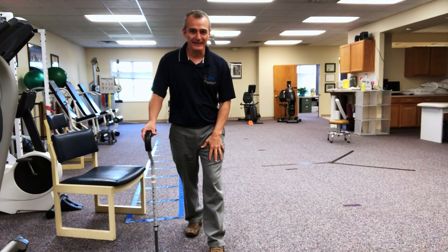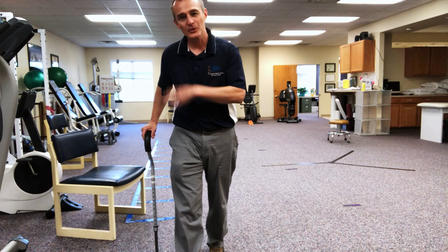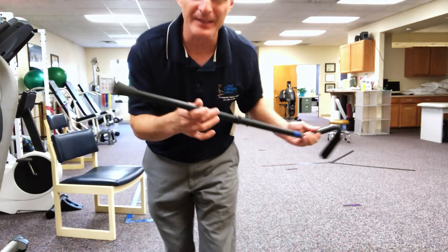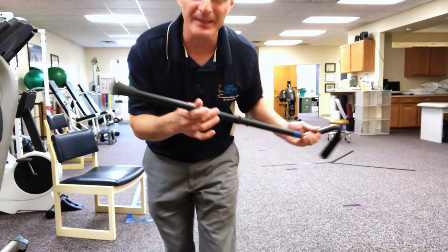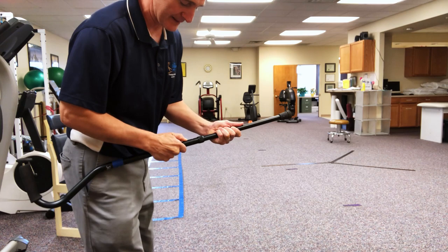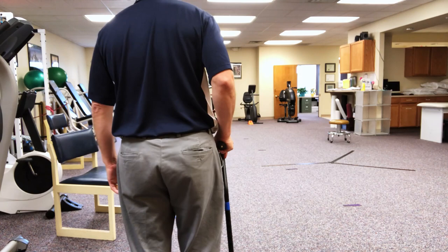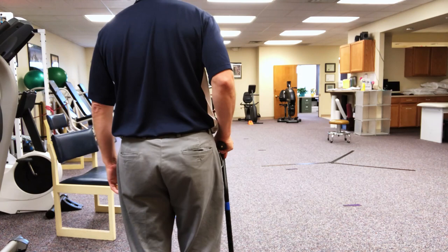The pattern is: cane and surgical leg move forward together, then the non-surgical leg pulls through. I'm going to switch to the single-point cane — what most of you will use — and do a demo walk all the way down and back so you can see what it looks like. Assuming my left leg is the replaced side, I adjust the cane height to line up at the wrist, and then: step — surgical side — step through; surgical side — step through.